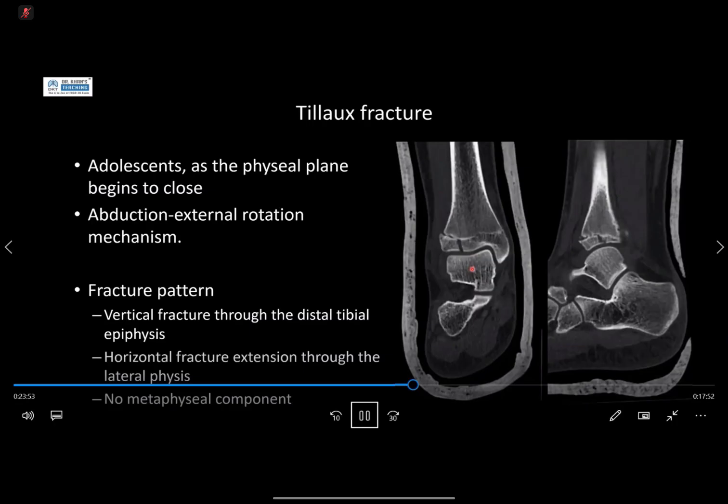Okay, they can be hard to spot and easy to miss. So if something doesn't add up, you could go back to the clinicians and say low yield for MRI, like you rightly mentioned. But of course, if you can see it on the X-ray and they just want to know how to manage it surgically, then sometimes they ask for CT for better characterization.